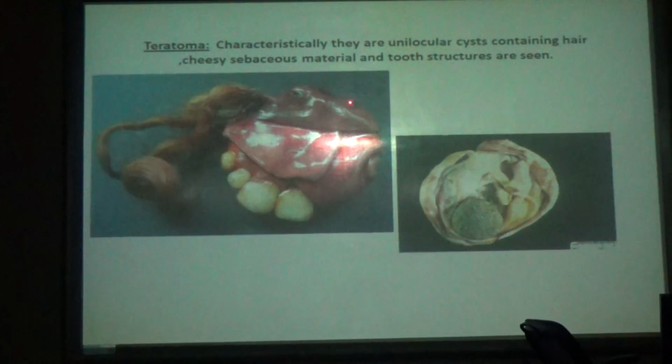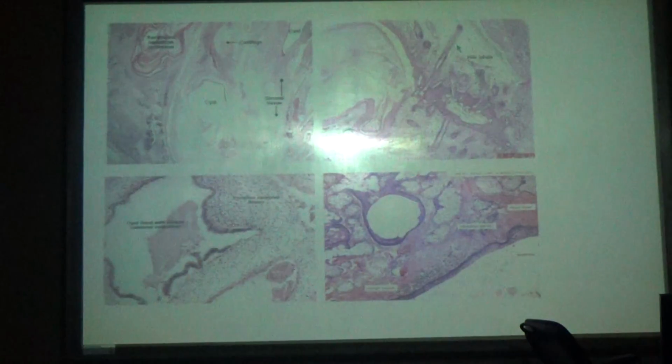So in one tumor itself you will see hair, tooth, sebaceous glands, papillary glands, brain tissue, thyroid tissue, respiratory epithelium, cartilage, bone, everything. We will call it teratoma. This is the hair ball. These are the various thickenings. All this thickening shows you various tissues of other glands. What you are seeing is keratinous squamous epithelium, cartilage, stromal tissue, cyst.